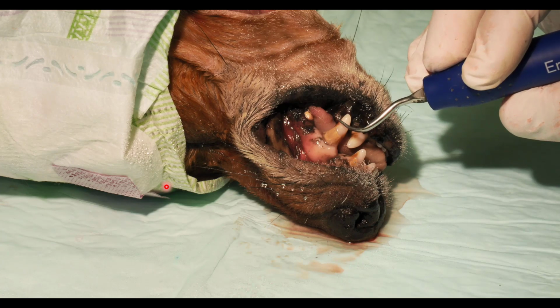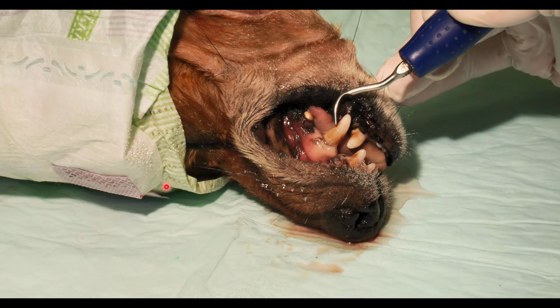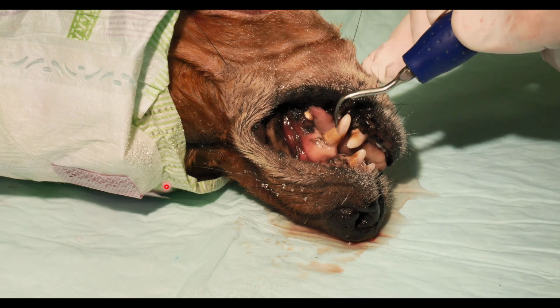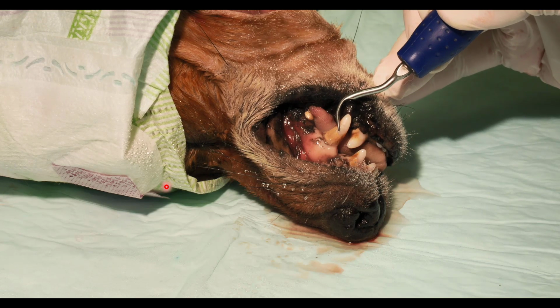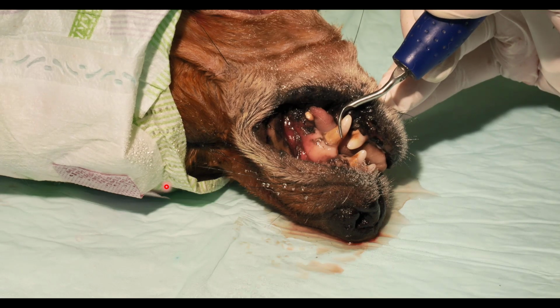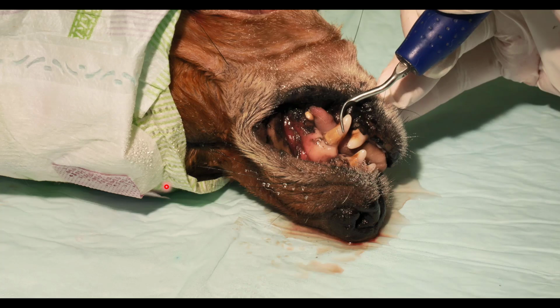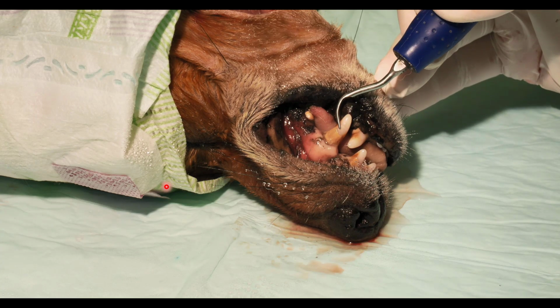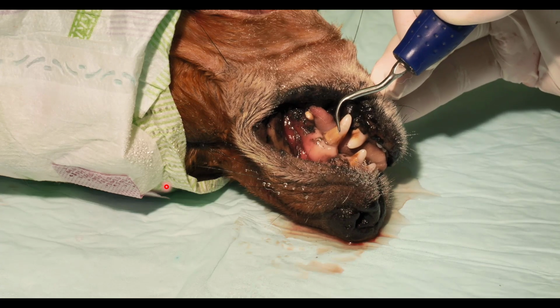Okay? The area of maximum vibration is the last 2 to 3 millimeters from the tip. So you don't want to have it on the very tip. You want to have the side of the tip right like that on the tooth at all times. If you're getting back here too far, it's not going to be very effective. So if you're having problems getting the tooth clean, rotate the instrument in your hand so that you can get that sweet spot against the tooth.